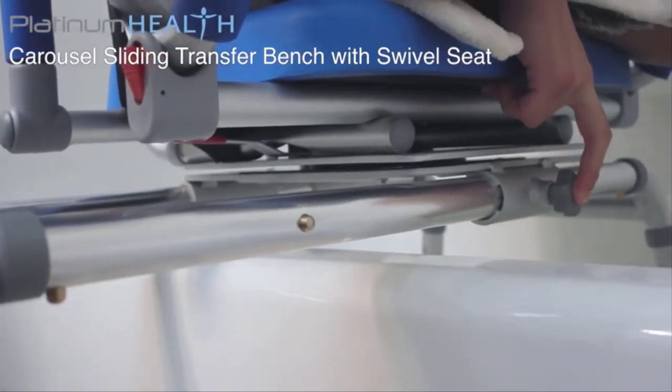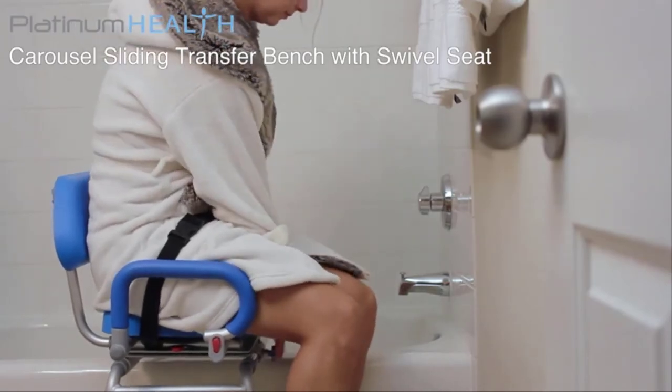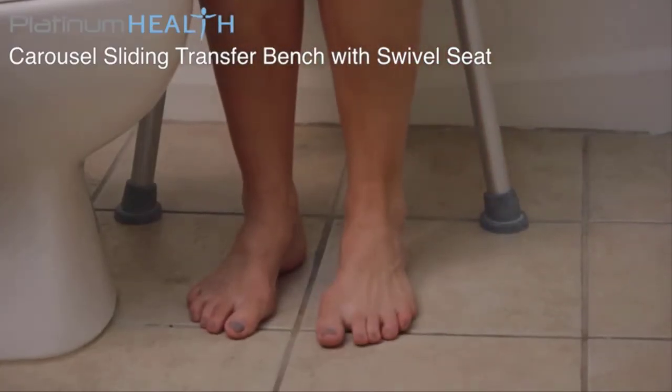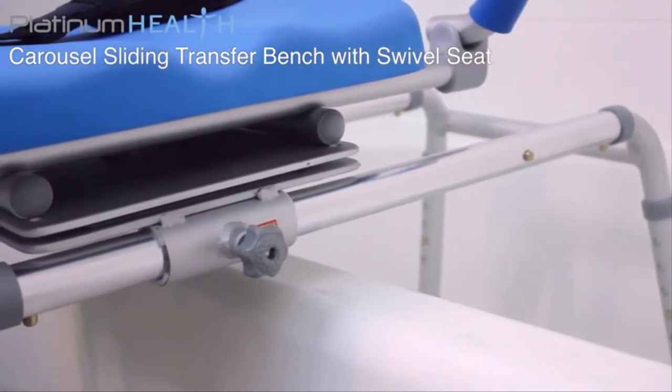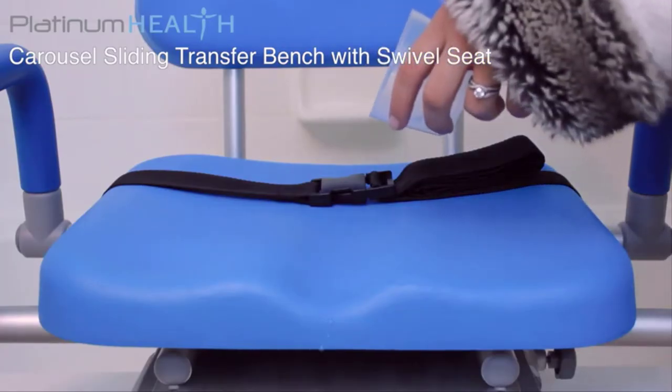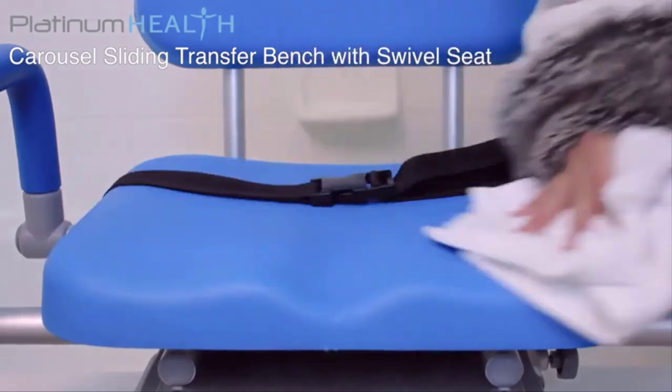Once bathing is complete, reversing the process allows bathers to exit the Carousel with their feet firmly positioned on a safe, dry surface. The rugged, stable, medical grade aluminum chassis will never rust and the commercial grade polyurethane foam padding will never absorb water. All surfaces are easy to clean and disinfect.